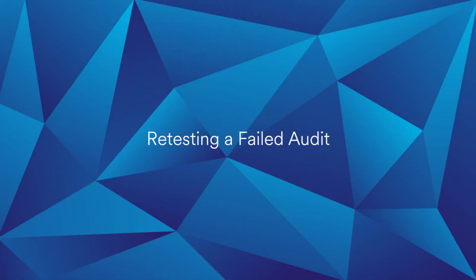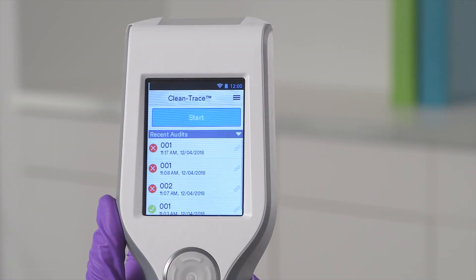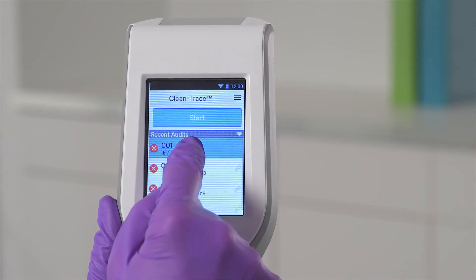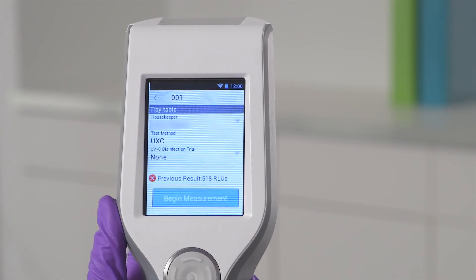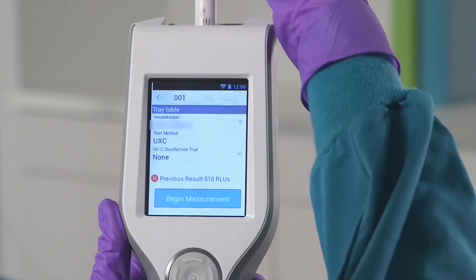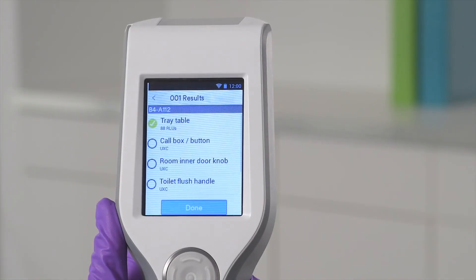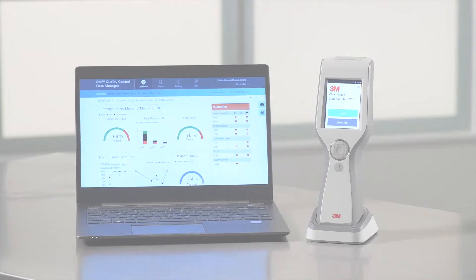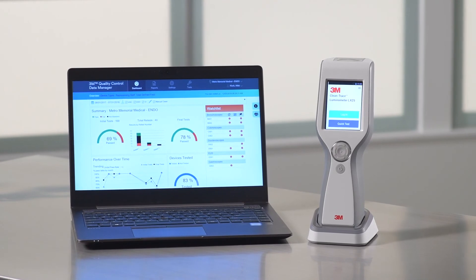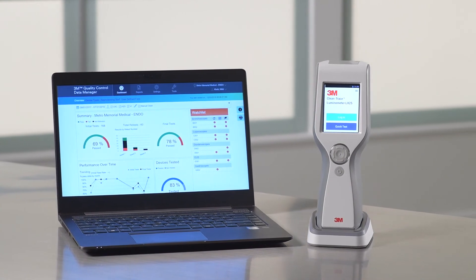Finally, we'll cover how to retest a failed test point. From the Start screen, select the recent audit that requires retesting — this is denoted with a white X in a red circle. Then select the test point that requires retesting, also denoted by the same white X in a red circle. Follow the prompts to complete the retest. Select any additional failed test points for retesting if required. When you have finished the retesting process, select Done. All retest data is recorded on the Luminometer. In addition, results can be uploaded from the Luminometer to the 3M Quality Control Data Manager, so you can collect, review, and manage your cleaning monitoring test data.